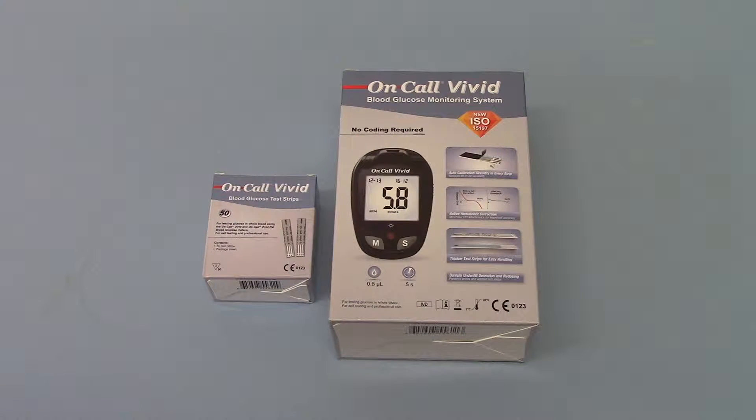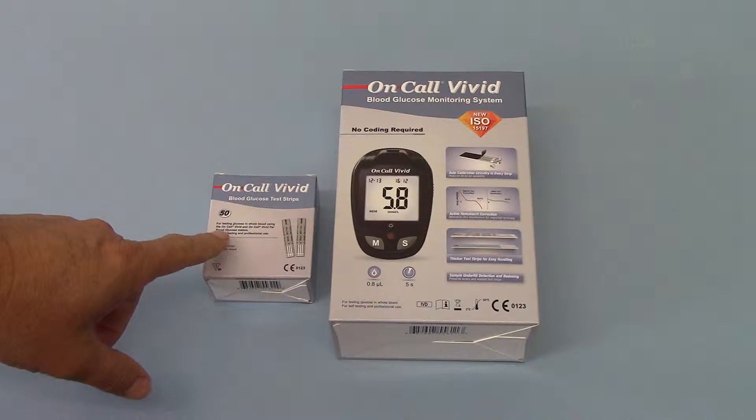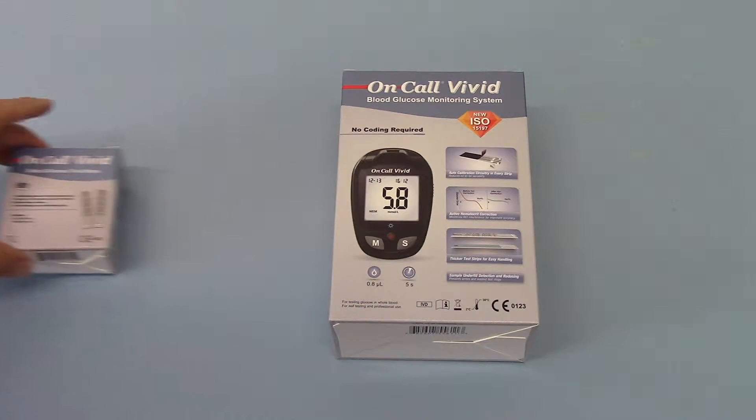Welcome to this product demonstration video. We're going to show you today the new OnCall Vivid Blood Glucose Monitoring System. What you're seeing here is the outer packaging. This shows both the packs of 50 test strips, which are the consumable extras.